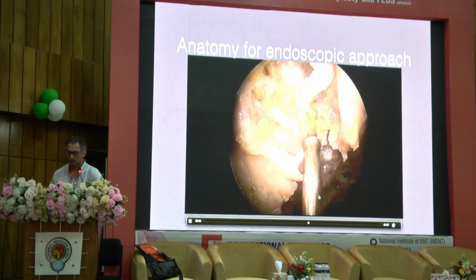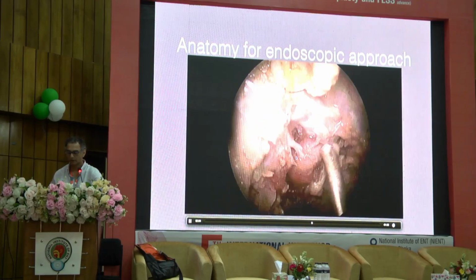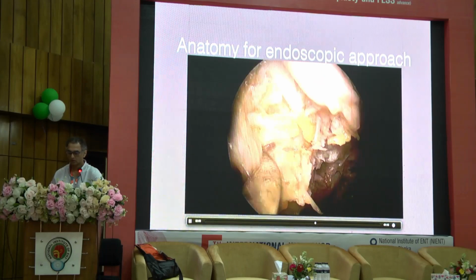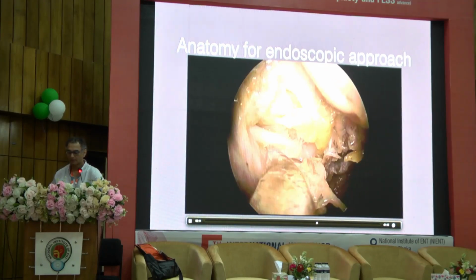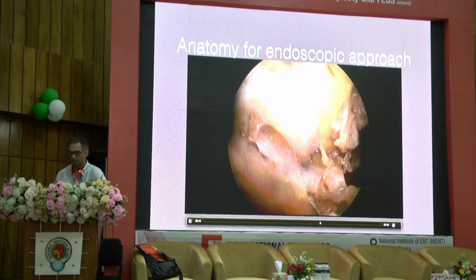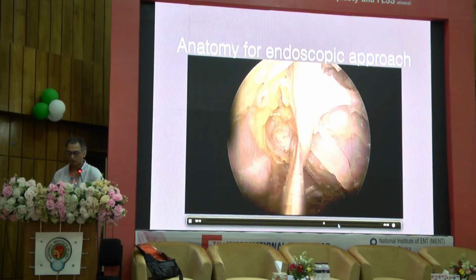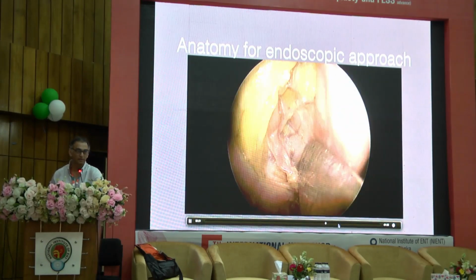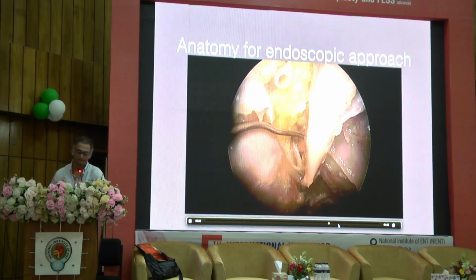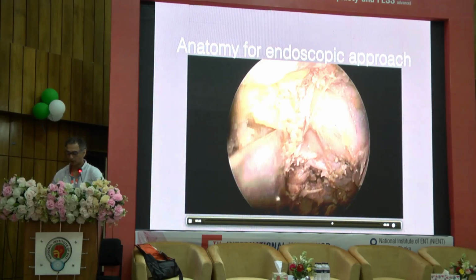And we can follow it back here. Okay, so that's the carotid artery. And the carotid, let's go back here. So this is ciliary ganglion as it comes off from the superior orbital fissure and all the different branches of the third nerve. Okay, so this is just to give you an idea of what the orbit is, how to do orbital surgery, and if you have a complication, what you have done to get to that point. Okay, right, that's the fourth cranial nerve supplying superior oblique. We'll go a little quicker here.